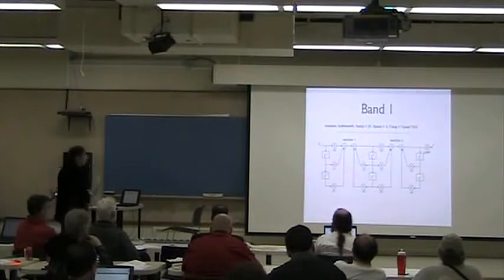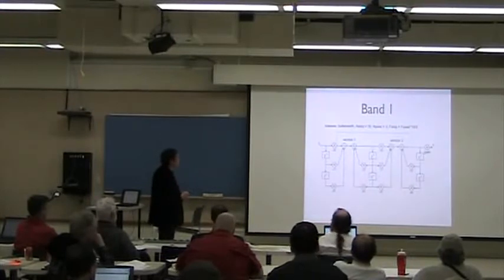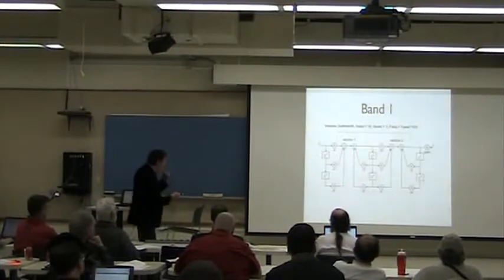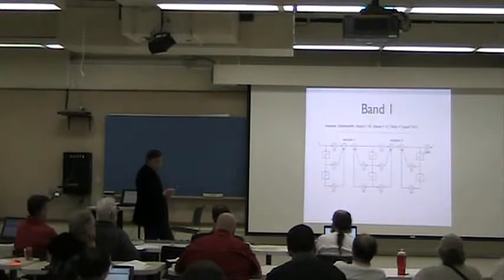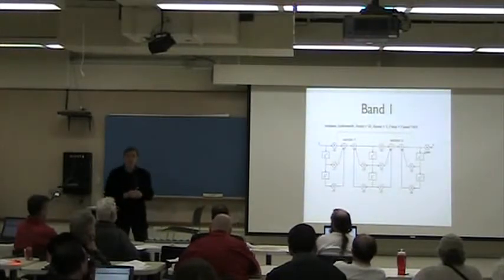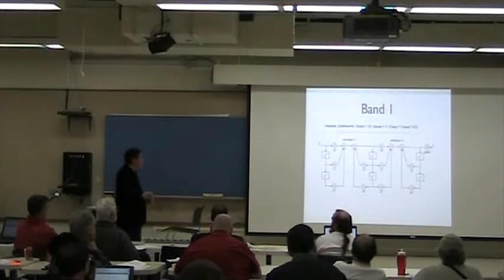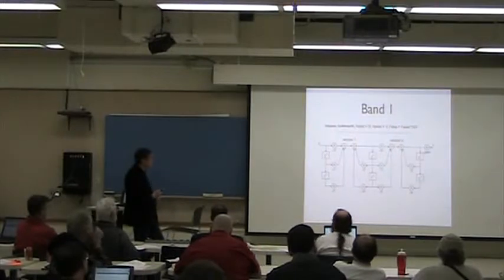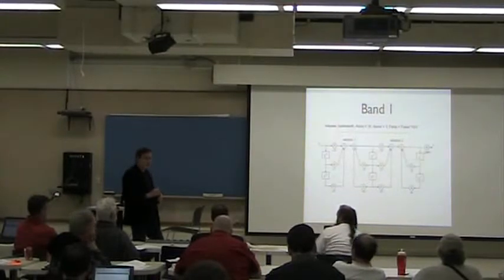And this is the signal diagram of the filters. It describes how band 1 is implemented. We used standard second order sections to implement the filters. Whoever has dealt with digital signal processing knows about these things. The challenge was to pack as many second order sections as possible into a single core.